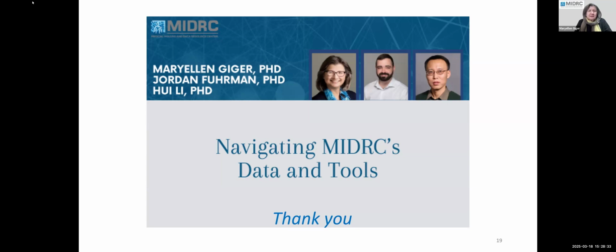Let's see, there's one here. Would we have to submit our data, or would users be able to access data from other repos using an API? Well, today we've talked about tools, and you can use these tools on your own data, but I'll pass that one to Jordan. With MIDRC, you can use APIs and access MIDRC data. For others, it will depend on the data commons, but I'll leave that to Jordan if he wants to broaden that.